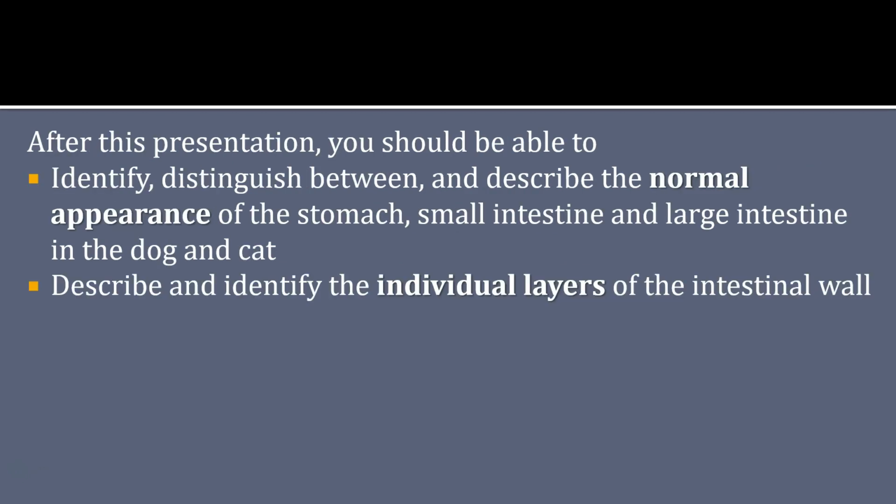After the presentation, you should be able to identify, distinguish between, and describe the normal appearance of the stomach, the small intestine, and the large intestine. And I want you to be able to describe and identify the individual layers of the intestinal wall.